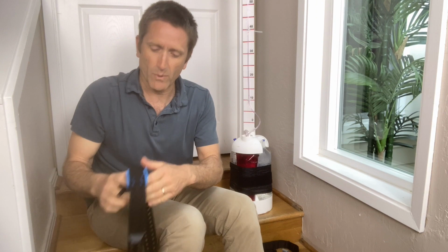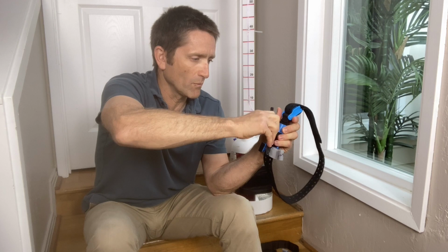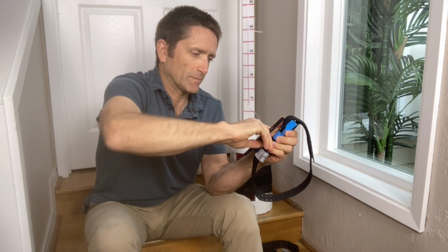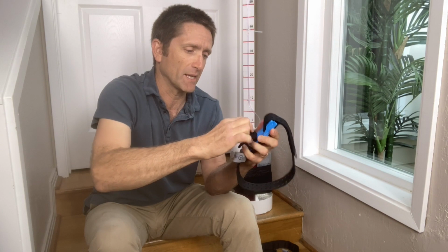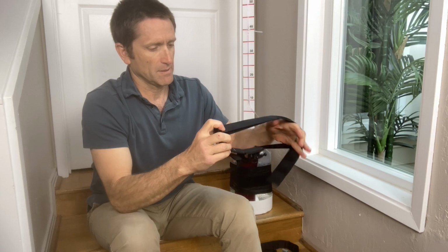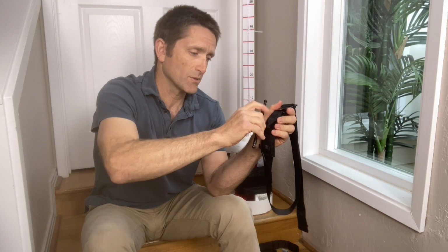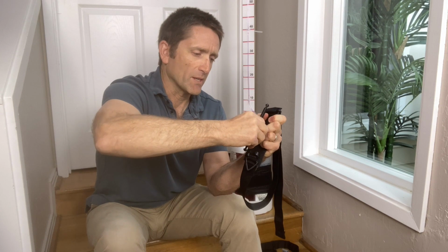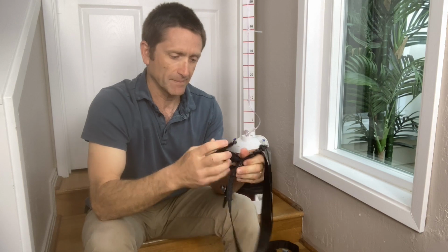Let's review a couple of other windlass tourniquets here. So this is the SAM XT. What's my tourniquet runway? I've got 1, 2, 3. Right now it's deforming, 4. All right, so 4 is about as many as I could get here. But I have the SOFT-T. Make that long. Actually, it doesn't matter in the case of the SOFT-T how long that one is. So I got 1, 2, 3, 4, 5. All right, so 5 turns, maybe 6, but that would be a little bit absurd.